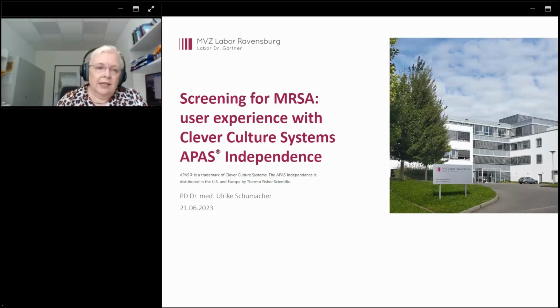So in this situation, we appreciate very much the possibilities of new automatic systems and artificial intelligence applications, provided they fulfill the requirements of sensitivity and specificity compared to conventional microbiology methods, while simultaneously saving working time.